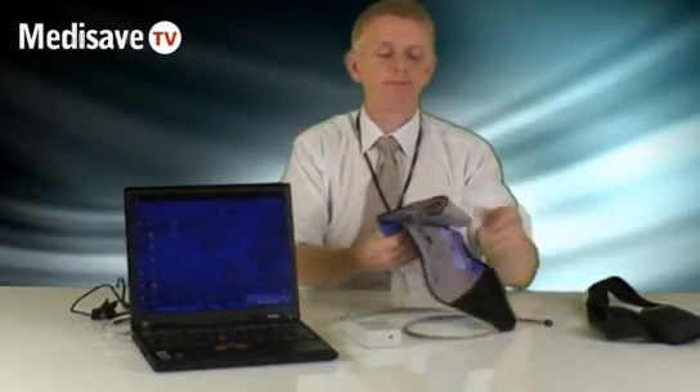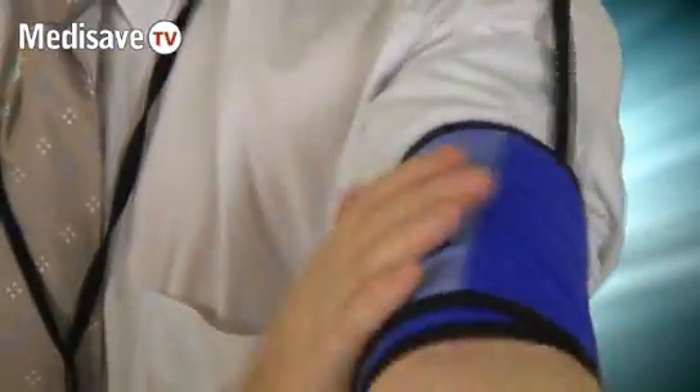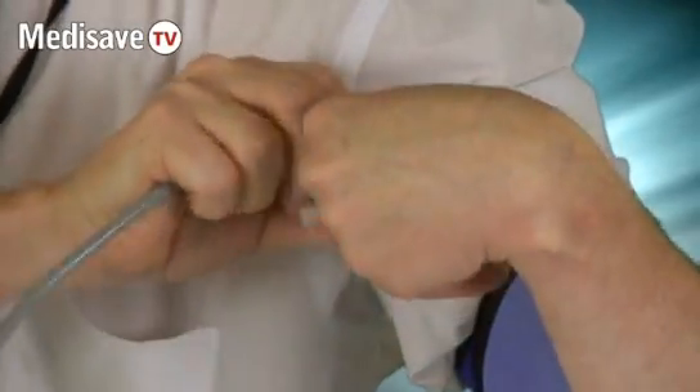It connects to the patient with this cuff, and the cuff has a separate sleeve on it for easy fitting to the patient. On the outside of the sleeve there's an artery marker for correct positioning. You wrap the cuff around the patient's arm into place and then connect the cuff to the unit with the cable.